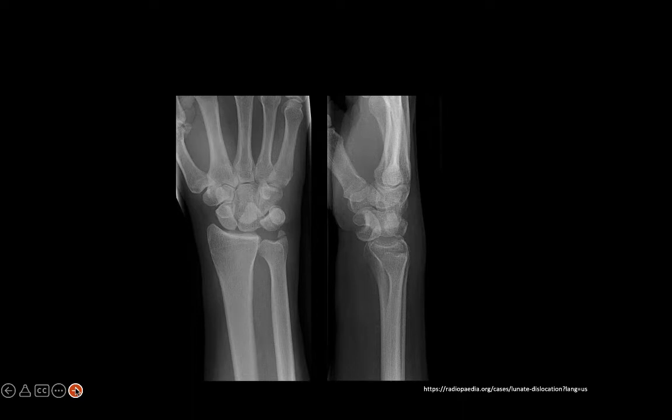All right, now here's an example of polytrauma. Well, it's probably a single trauma, but there's multiple findings here, and that's really a tribute to not being satisfied with your search. So when you go through films, it's really important to look at all the images and also to just assess all the anatomy. In this particular case, the patient had some sort of hyperextensive trauma to the wrist, most likely based on what's going on here. And when we talk about the arcs of carpal alignment, they are abnormal here.